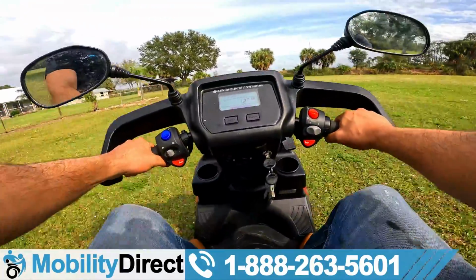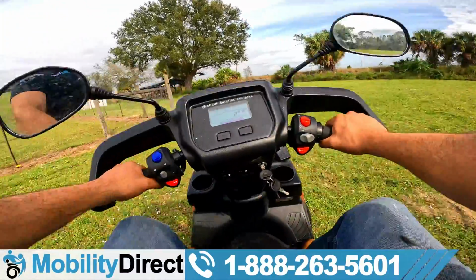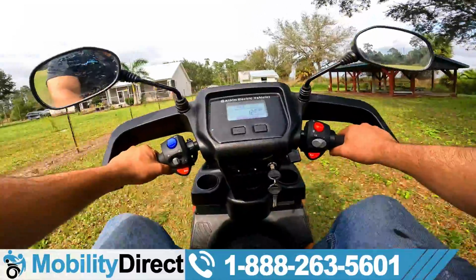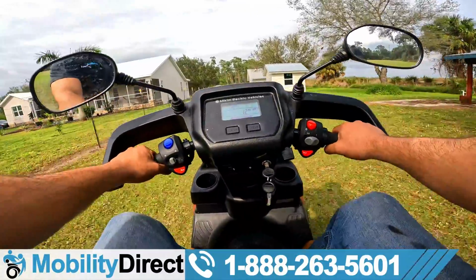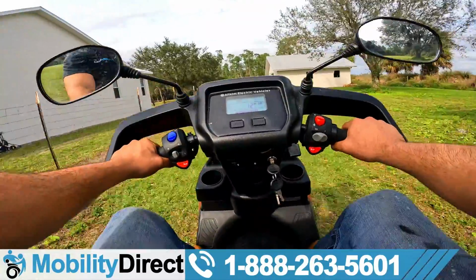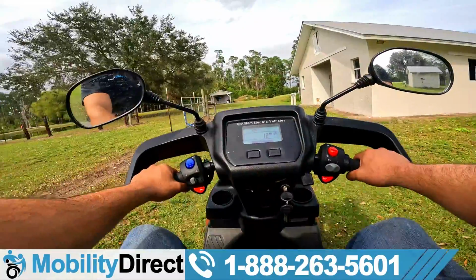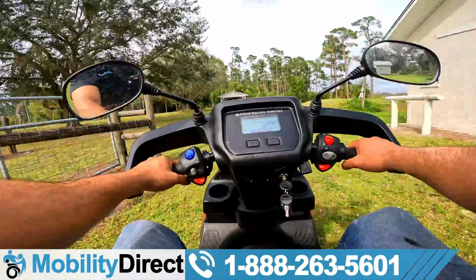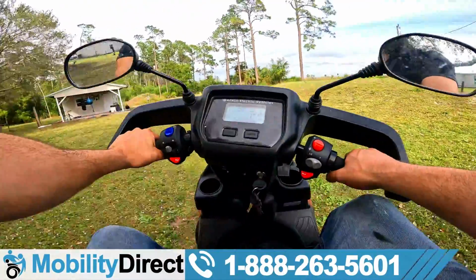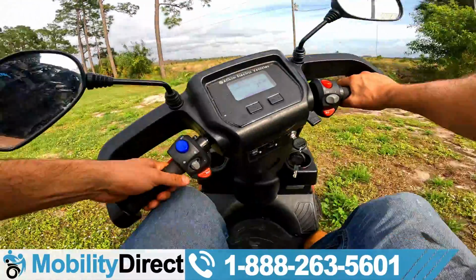All right, so we can safely say that it's working just fine now. I just hit 12 miles per hour, going over all kinds of bumps, and it's not giving me the error 1 code anymore. So we've successfully diagnosed and fixed the issue. It was just a loose connection. Now, if it wasn't just a loose terminal screw like how we experienced in this case, you may need to check all the different wires that lead from the battery to the controller, but the concept will be the same.